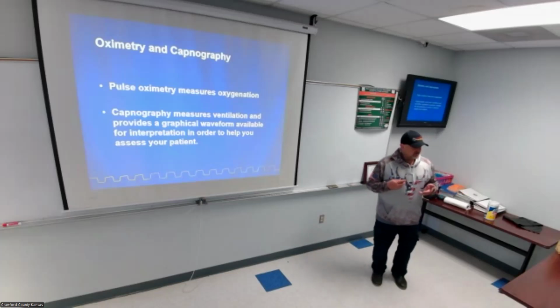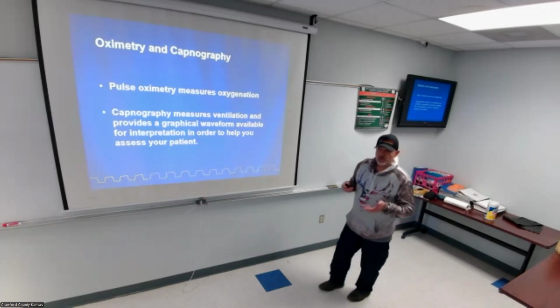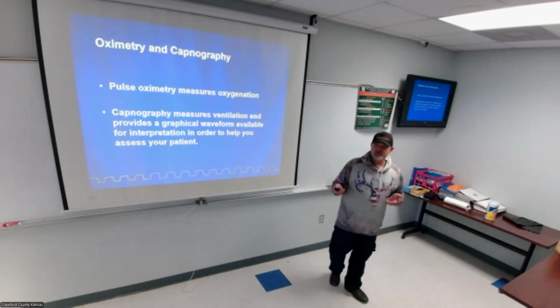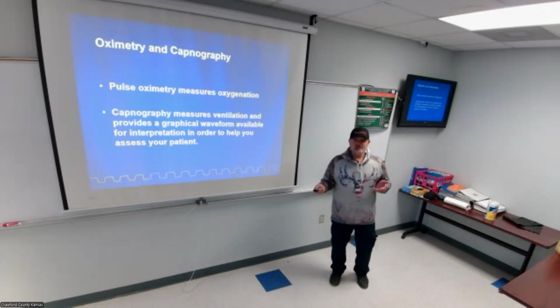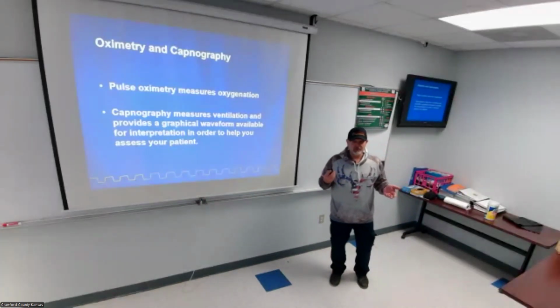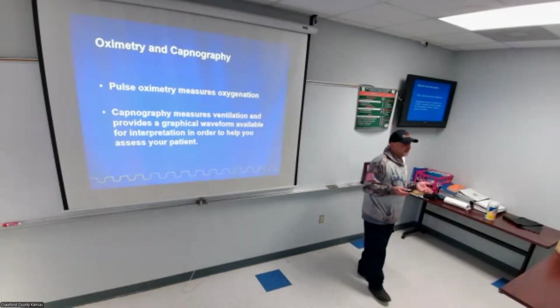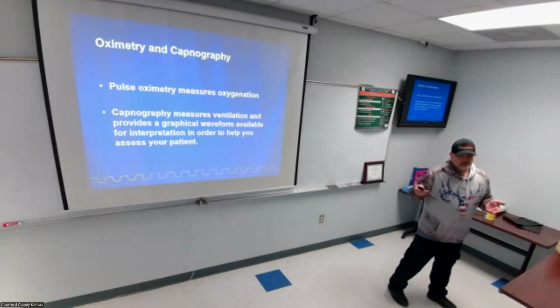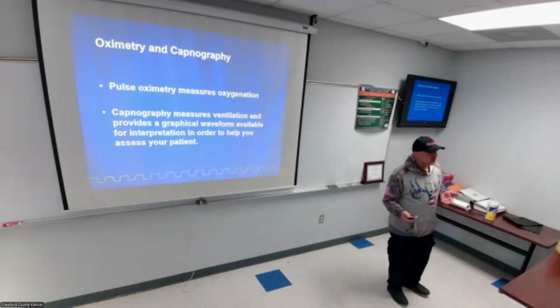So this patient has end tidals of 23, 24, but they have some expiratory wheezes going on. We want to go ahead and treat these expiratory wheezes with albuterol, secondary to our alveoli still clamping down on the upper lobes, but the lower lobes are full of fluid. Now, that's going to be a personal decision on your side, because you're able to treat the wheezes, and clinically, it's the right thing to do.